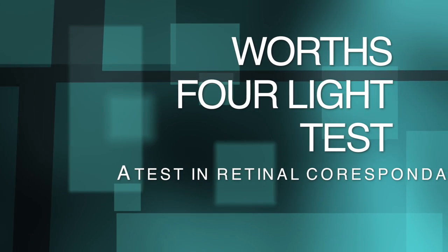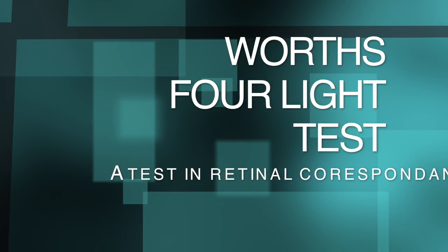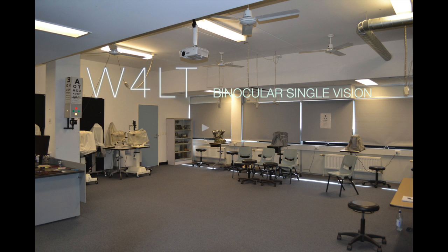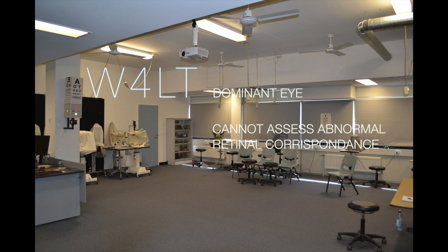This is a demonstration of how to perform a Worth 4 Light test. The Worth 4 Light test is a binocular diagnostic tool useful in investigating retinal correspondence, which is the relationship between the area stimulated in the strabismic eye when fixing with the other eye. It is used to detect the presence of binocular single vision, suppression, or diplopia — double vision. It can also be used for determining the dominant eye. Because it is dissociative in nature, it is not used to establish abnormal retinal correspondence.